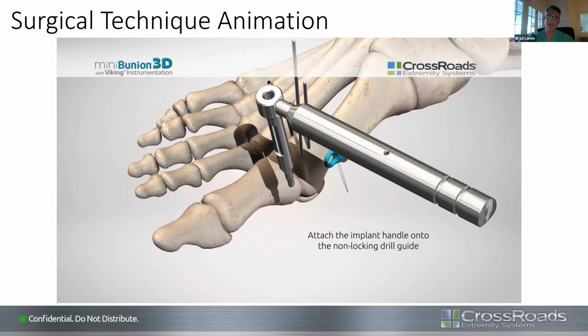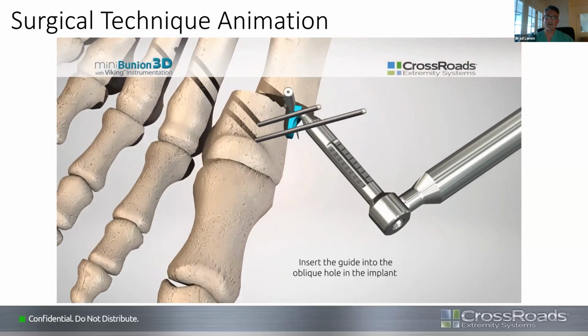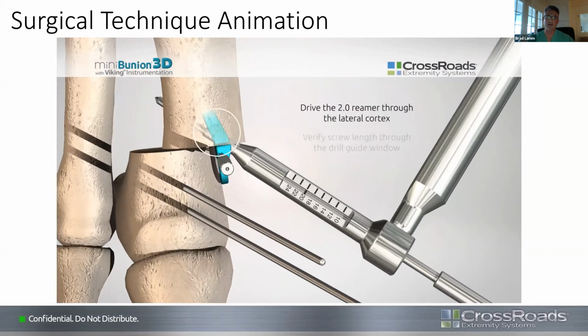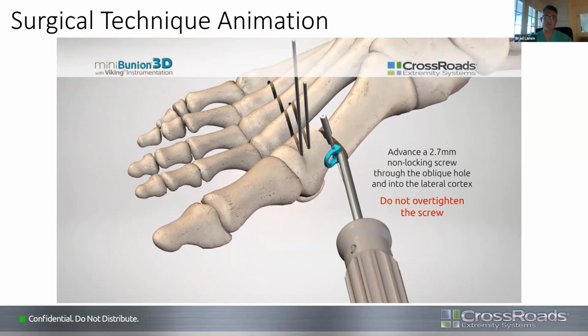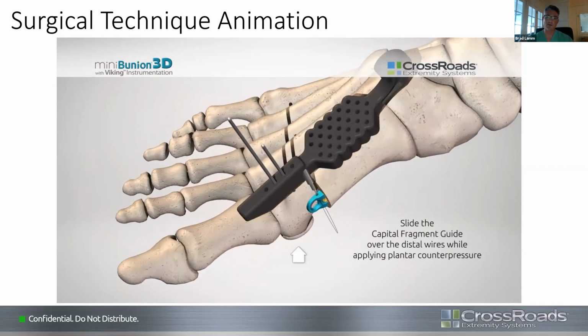Then we want to fix the intramedullary device to the proximal metatarsal. And what you use is this guide, and you can read right off the drill the depth of that screw, usually somewhere between a 14 and an 18. This is a non-locking screw. We put this in, and that maintains your proximal position and also maintains your translation. You don't want to over tighten that screw.